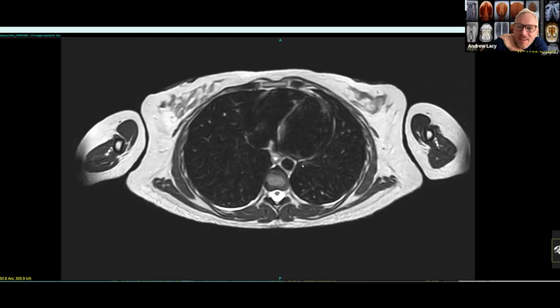Best time of the cycle to scan. You mentioned the uterus and the uterine lining is obviously changing. Is there a best time of the cycle to scan? Or if someone comes in for subsequent scans, should they come in at the same time of their cycle? What do you recommend around this? I really have no strong recommendation in that regard. For a premenopausal female, I expect that the endometrium is going to be variable in appearance, and that's okay with me because even if it's thick and a little bit heterogeneous in appearance, I attribute it to the menstrual cycle, unless there were specific symptoms that needed to be evaluated or there were other concerns. In an asymptomatic person who's looking for general screening, there's really no strong recommendation there.